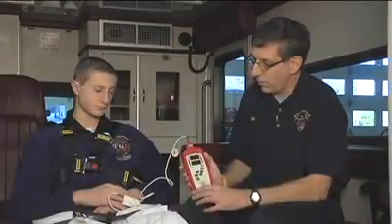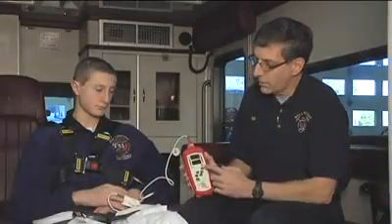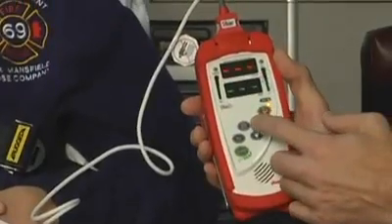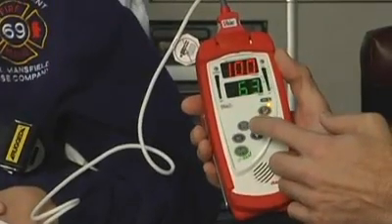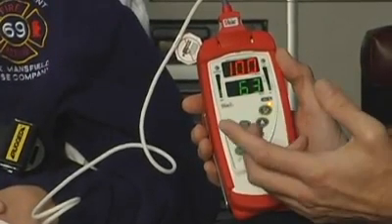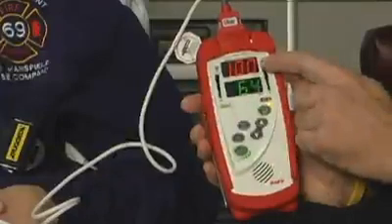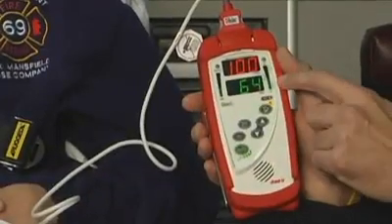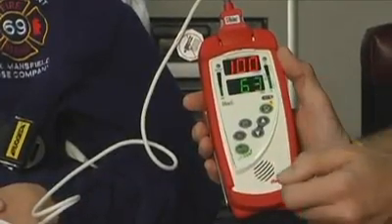Then we'll watch the pulse oximeter as it boots up. It's going to collect a pulse ox reading — you can see it's 100% here — and the heart rate from the patient.